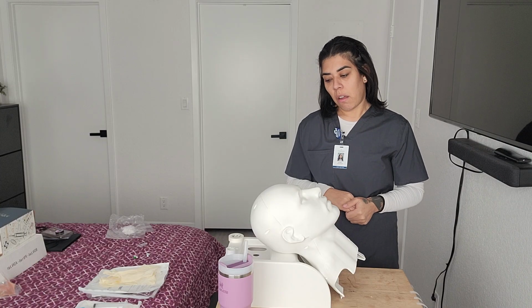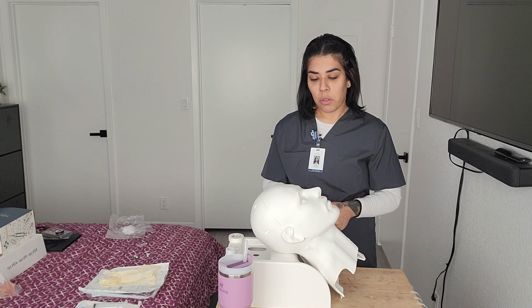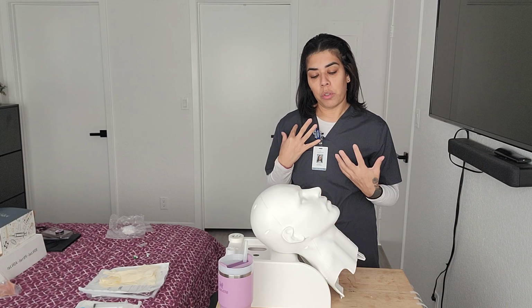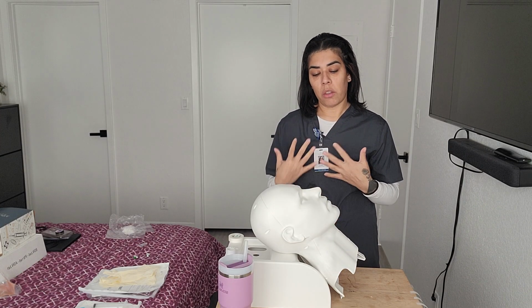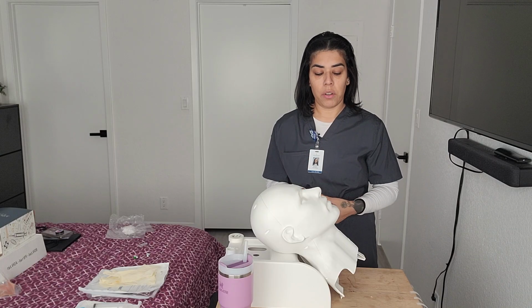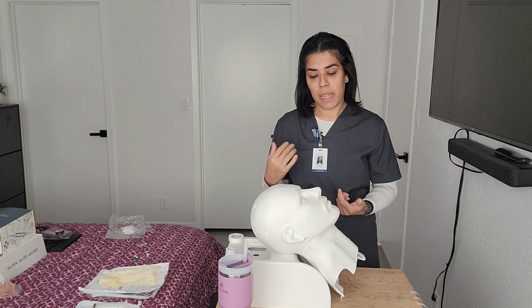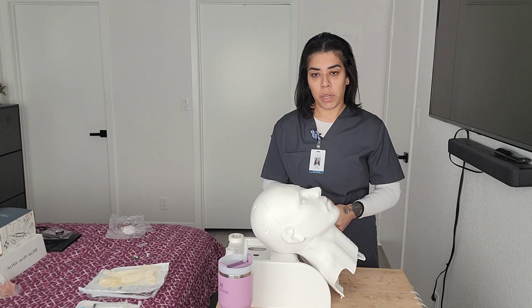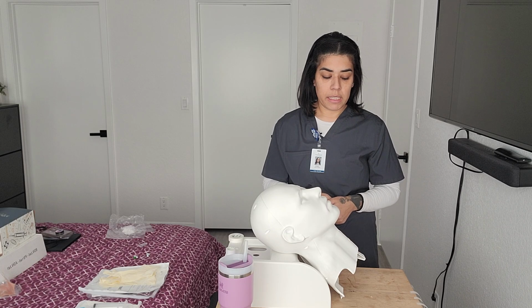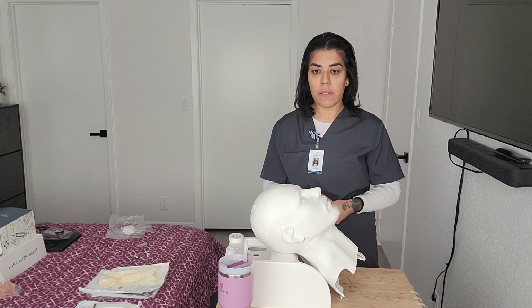So the doctor has gone ahead and ordered an NG tube insertion for you. It seems like you've been having trouble swallowing your food. You kind of seem to be choking. It seems like the food is going to other places like your lungs, instead of your stomach. So the doctor has ordered for us to go ahead and place the NG tube for you. Do you have any questions before I continue with the procedure? The patient doesn't have any questions.